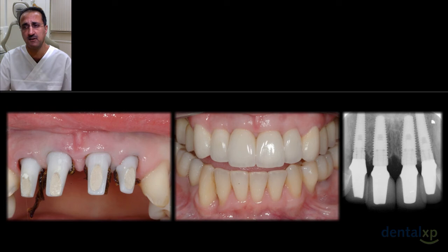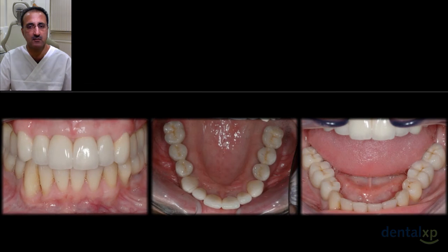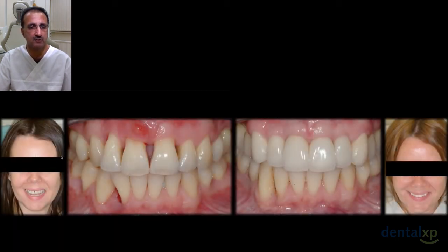And this is how it looks at this stage, and you can see this kind of unusual sort of negative architecture around the teeth, but you see the restoration now, more or less with final restorations in position. This is how it started out. You can see again the lip line wasn't so much of an issue, but the black holes here were, and you can see that we've now changed the shape of the teeth as necessary, less triangular tooth form. But we've now created a stable and somewhat more symmetrical architecture.